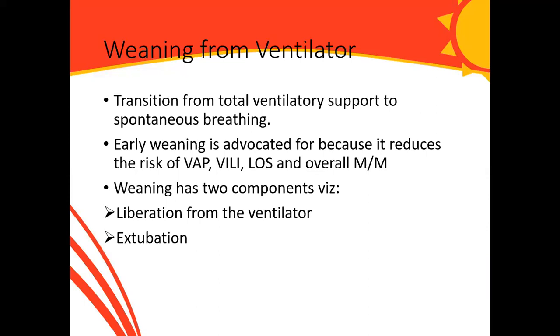Good evening. So let's start our lecture today as we continue our lecture on mechanical ventilation. We'll start with weaning off from the ventilator. We said in the last lecture that before a patient is connected to the ventilator, you must ensure that the indication for the mechanical ventilation is reversible. Therefore, it's important for us to wean the patient off the ventilator.